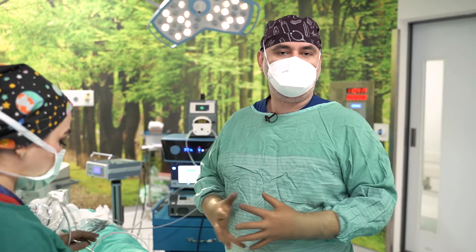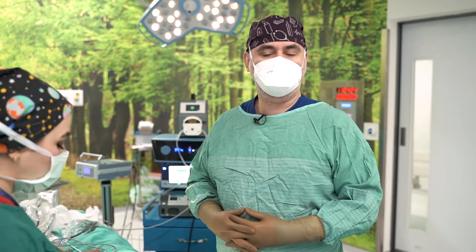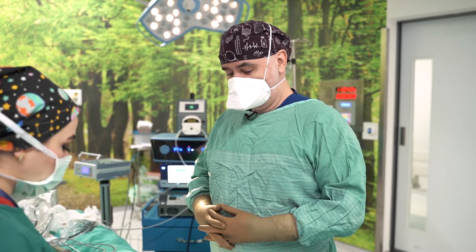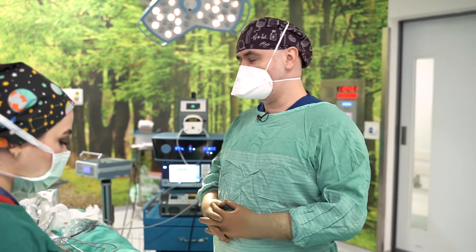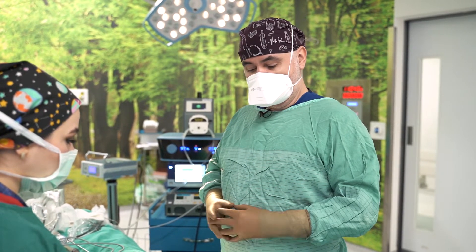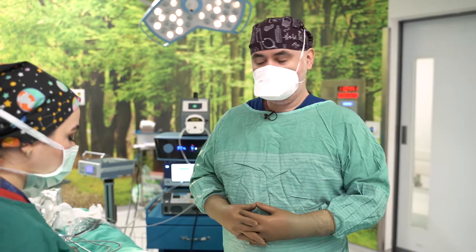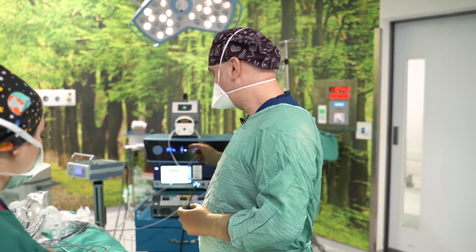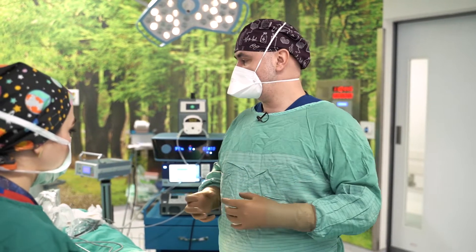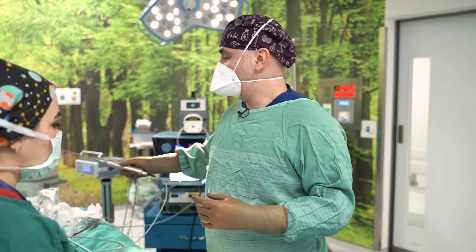Hello again. Now we will start our surgery. We perform this operation under general anesthesia because we will work in the abdominal region, flanks, upper and lower back sides. To start the surgery, first we infiltrate fluid into the operation field. This fluid contains adrenaline and we use it to decrease bleeding. After that, we wait around 10 minutes and then we start the laser, which we use for melting the fat.